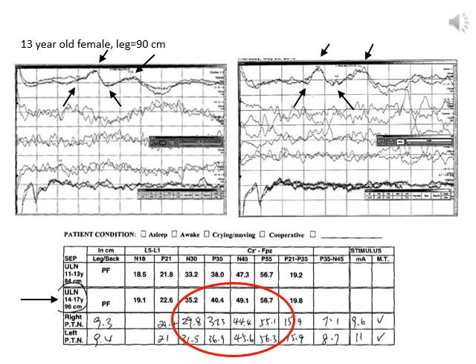We're going to jump up to the top tracing, which is the cortical response, as it is a little easier to identify the cortical responses than it is to identify the lumbar responses, so we'll save the lumbar responses for last. A typical cortical response looks like a big M. So there's an N30 negative going, then a positive P35, an N45, P55, making kind of an M shape. Although there's a lot of individual variation on the second peak, the N45, P55, and so it may or may not be very big or clear, which is fine. So as long as the N30 and P35 can be identified, those are the mandatory components.